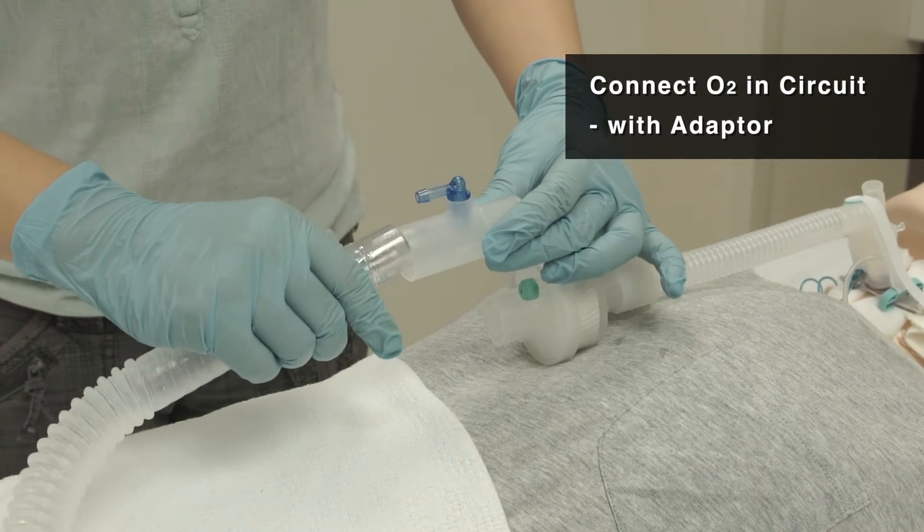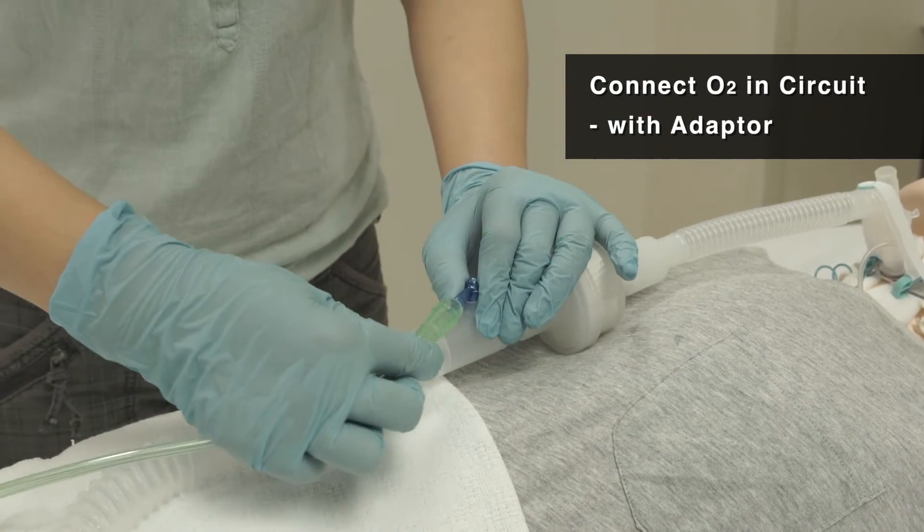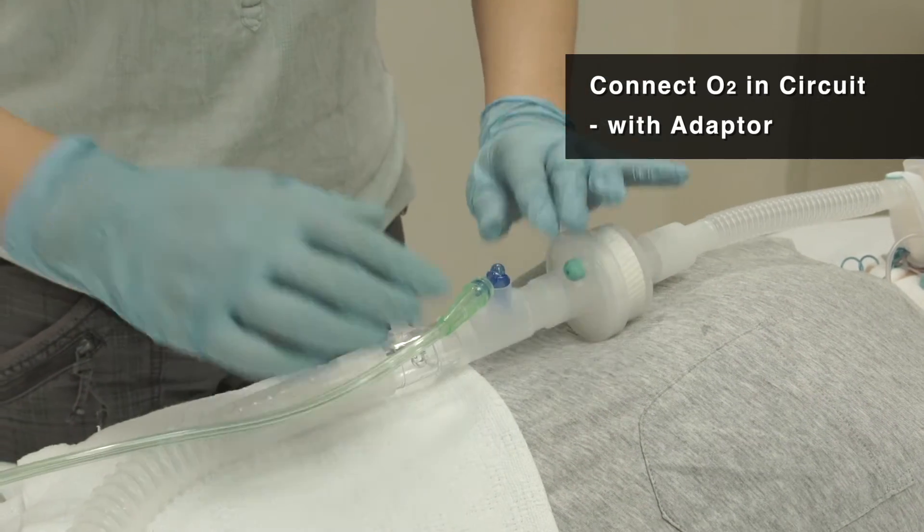Alternatively, the oxygen adapter can be used in the ventilator circuit. Connect the oxygen tube to the connector and join it in the circuit.